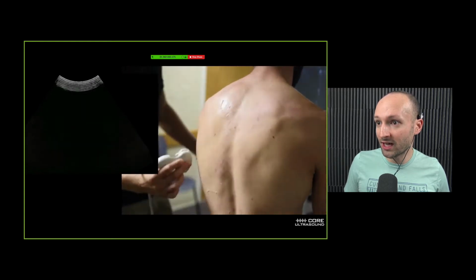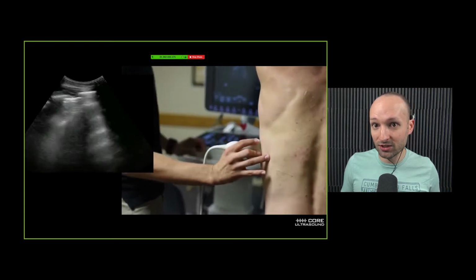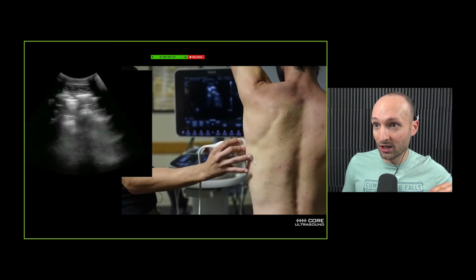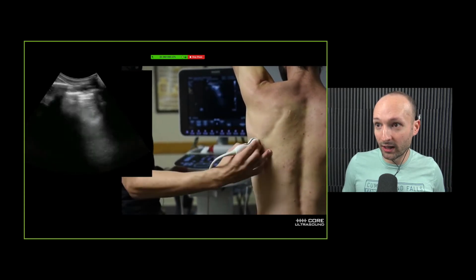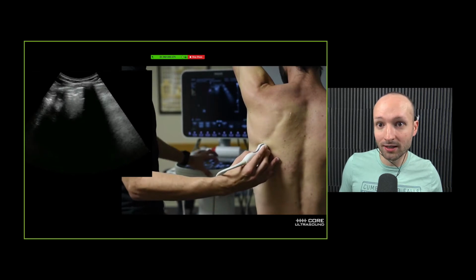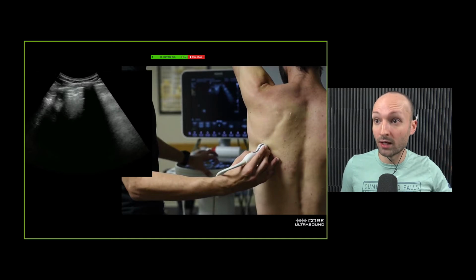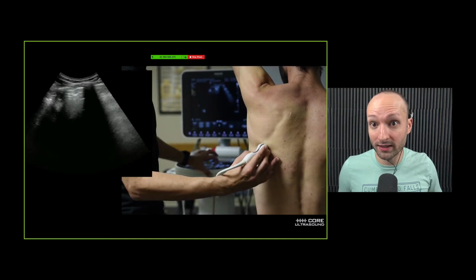Now, I'll do the same thing on the side. And remember, this is all pattern recognition. Do I see a pleural line with a bunch of A lines or not? So I do it in the lateral areas as well. Now, let's say right here at this spot, I find a couple of focal B lines. I find an irregular pleural line. Something looks different than what I am used to seeing or what I want to see, right?